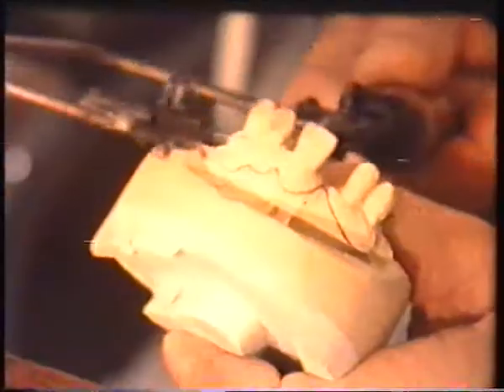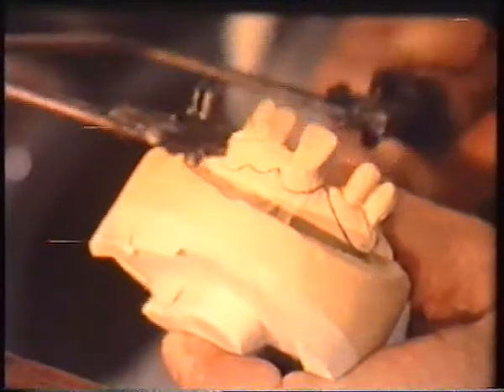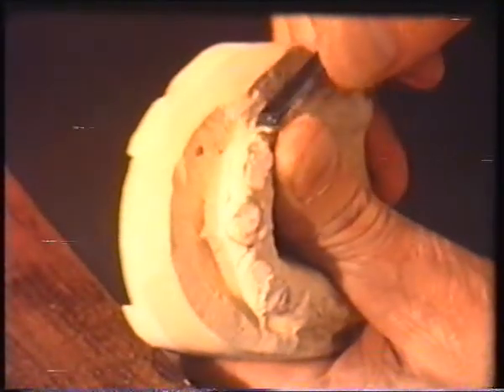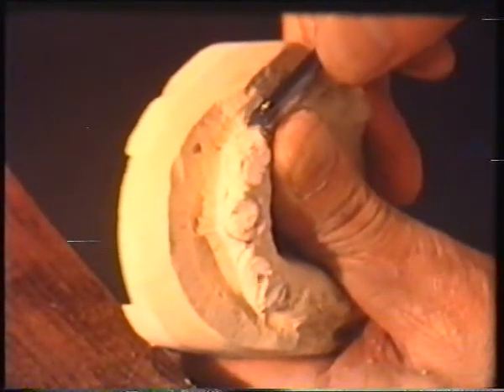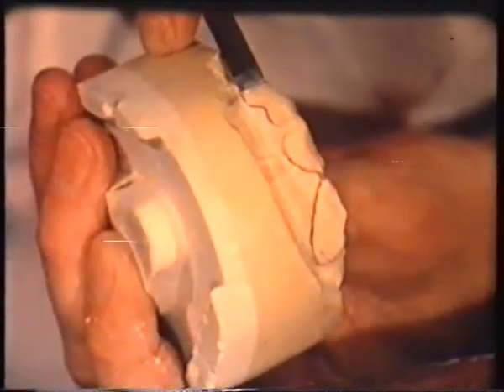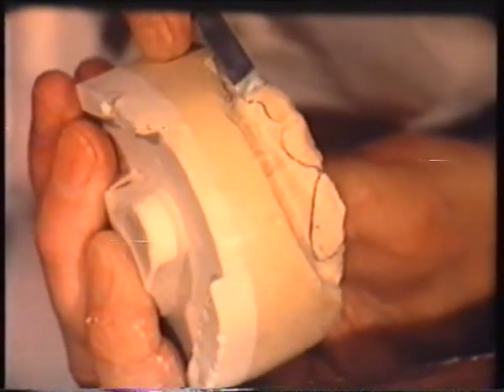When this has been done, the dentist, and not the technician, should cut the teeth off the models. He should trim the stone to the shape that the subsequent surgical removal of the teeth and the alveolectomy will produce in the patient's mouth. It must be remembered that room must be provided for the labial flanges without causing forward displacement of the upper and lower lips.